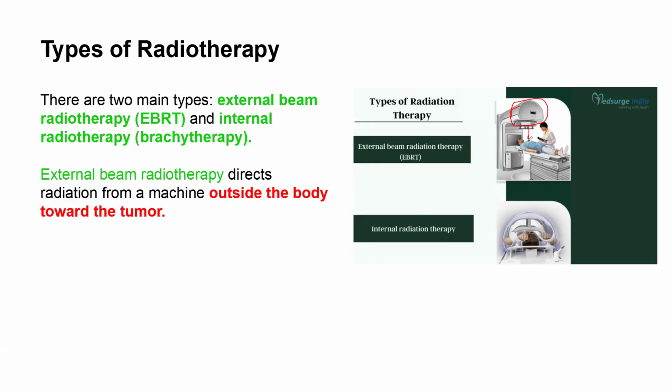So that is why it is called external beam radiotherapy, where the machine is outside the body and the radiation is directed toward the tumor.